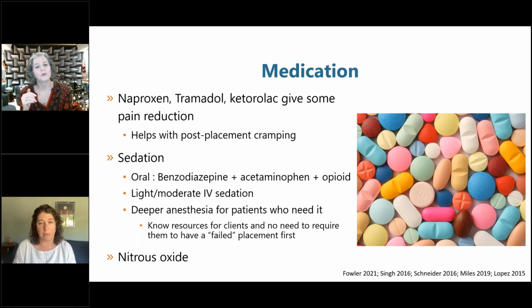One of the parts of that is that we all do it, right? Every place I've ever worked, people who are going to have an IUD placed were universally offered some sort of NSAID. But a lot of the data that show it isn't particularly helpful except for post-procedural cramping really are looking at administration that happened pretty soon before the procedure.